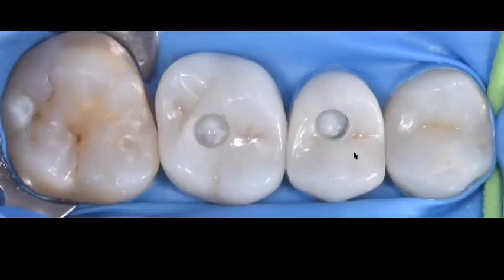So what I'm going to do now is create a good bonding surface for the zirconia crown. How do I do that? I do that by adding a primer, a zirconia primer, to the restoration. The one that I like in particular is one made by Dentsply, and it's called Monobond Plus. And the reason why I like Monobond Plus is because Monobond Plus is a trifunctional monomer, which means you can prime metal, etchable ceramics, and non-etchable ceramics with this primer.